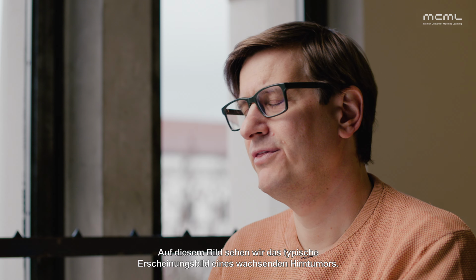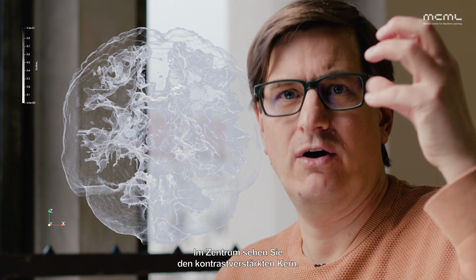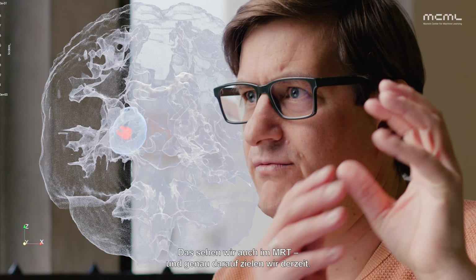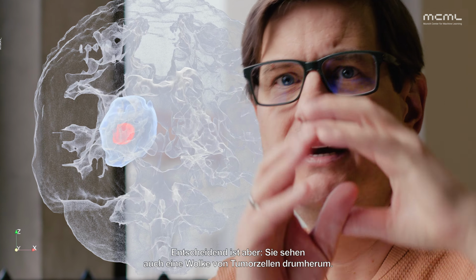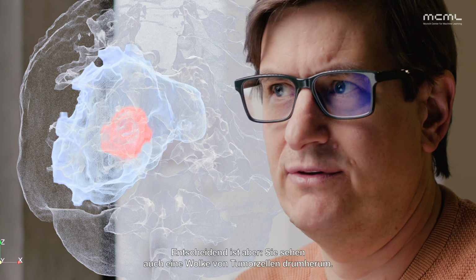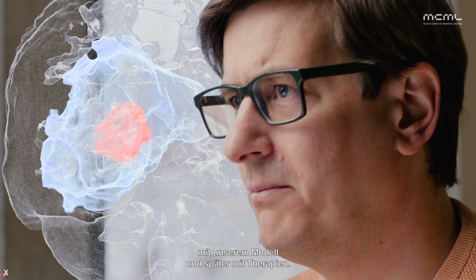alternative. So on this image, we see the typical appearance of a brain tumor growing in a patient. We can see that this tumor grows over time. You can see the contrast-enhancing core in the center of it. This is what we also see on MRI, and this is what we're targeting right now. But crucially, you also see a cloud of tumor cells around it. And these are the individual tumor cells that we want to target with our model and later with therapeutic approaches.